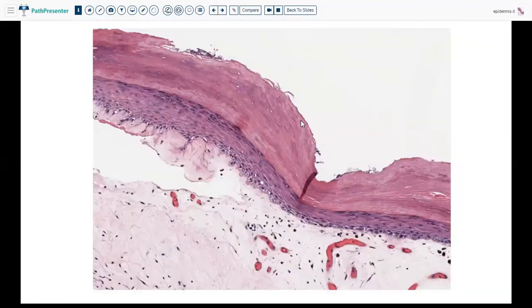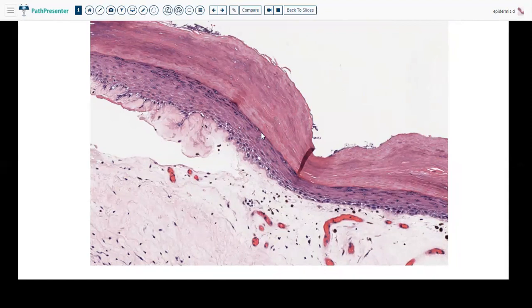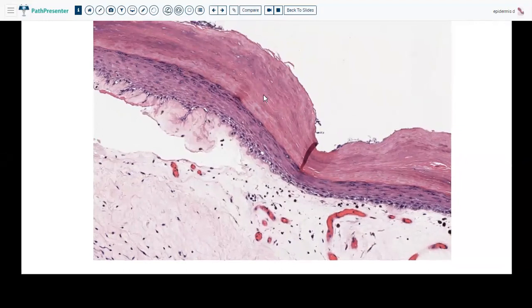Moving on to the next slide — a little bit of the opposite in terms of the spinous layer. We saw acanthosis earlier; now we see atrophy. Look how thin the stratum spinosum is. And in contrast, see how thick the stratum corneum is — this is also an example of hyperkeratosis. In contrast to the parakeratosis we saw earlier, what we see here is orthokeratosis, specifically compact orthokeratosis. This is an example of lichen sclerosus et atrophicus — the red stratum corneum, the thin epidermis, and the hyalinized white dermis, with a blue band of lymphocytes below.